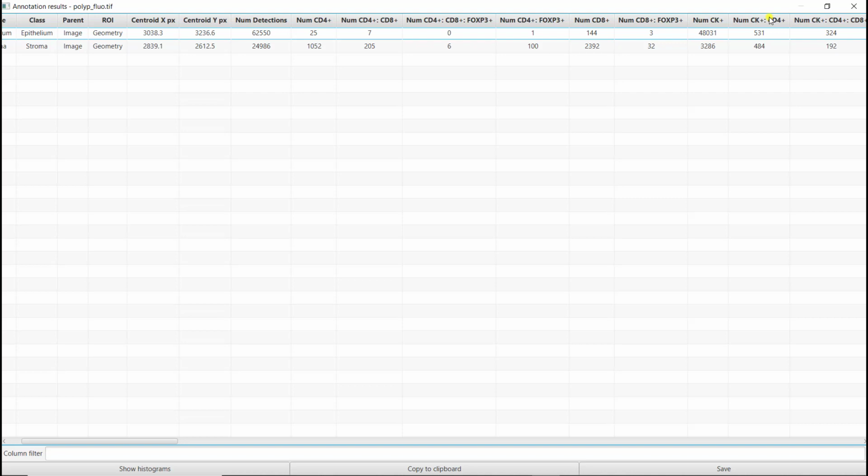You have to be careful when you do these kinds of things, and you definitely have to say, for example, if you write a paper, you need to write in the methods that you did this. But if you explain why you do it, and if you give a good explanation, then the reviewers can state if what you're doing is correct or not.